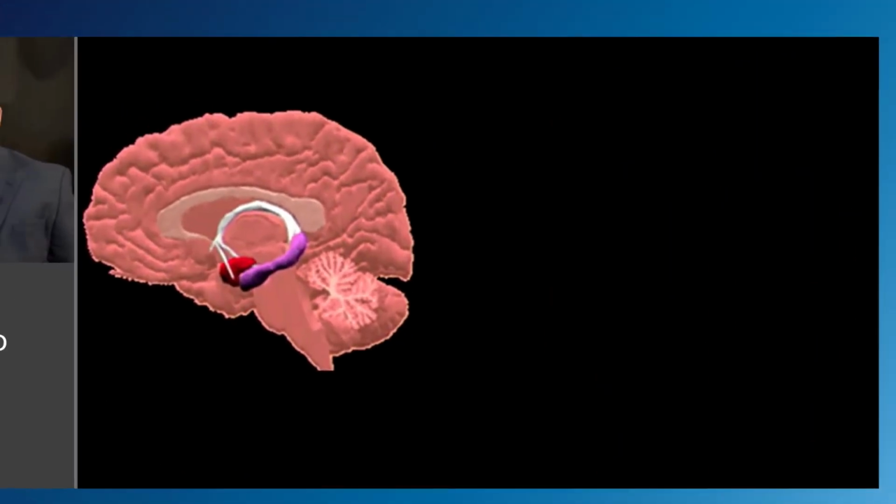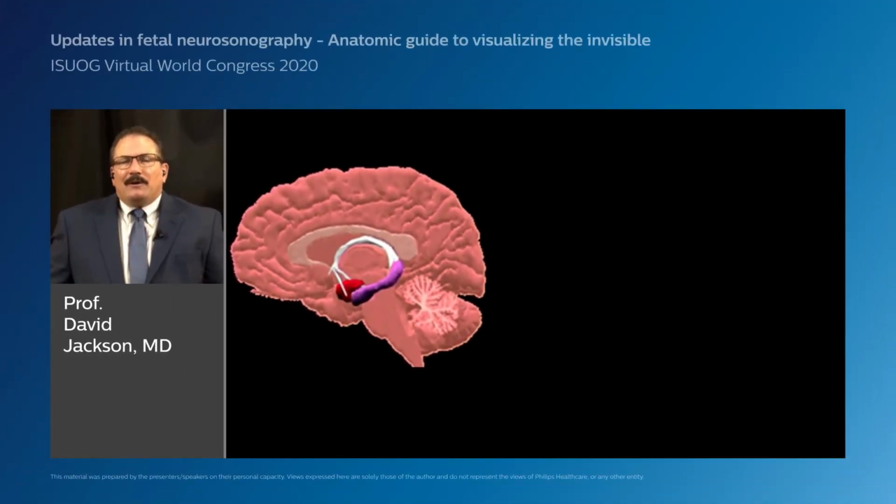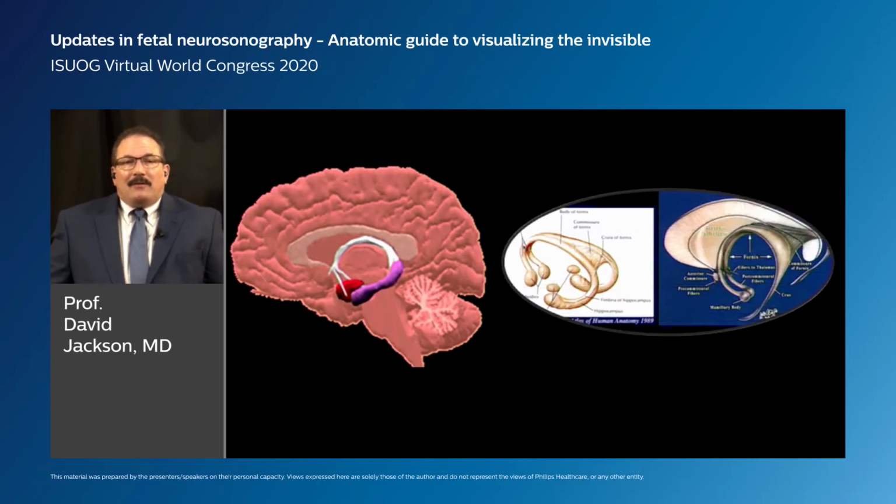Once we get past the point of the anterior commissure, however, the anatomy becomes even more complex. We have the columns of the fornix curving backwards to insert into the mammillary body, and also slightly outwards. Therefore, it is technically impossible to see the entire column of the fornix in one plane. You must be able to maneuver to find the curvature that is going back and outward.